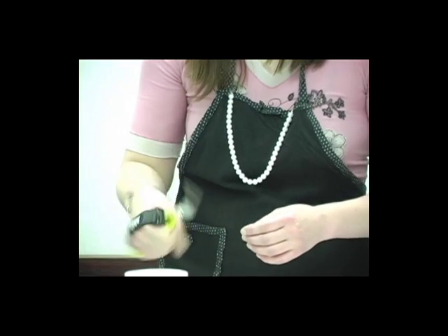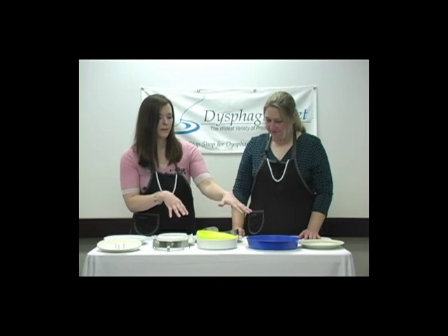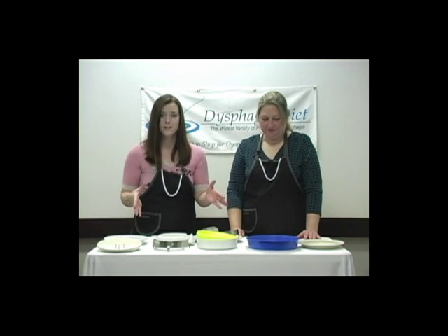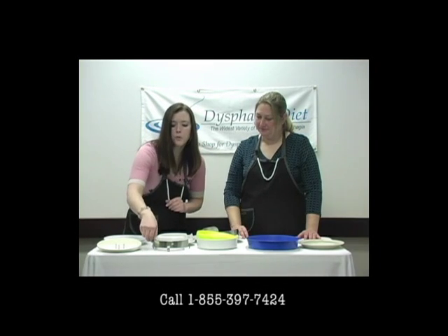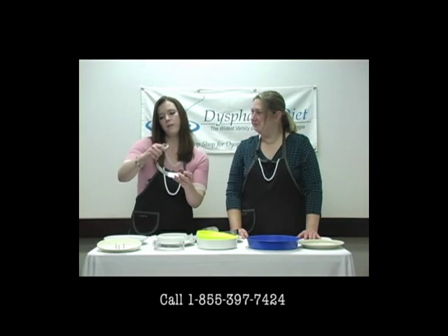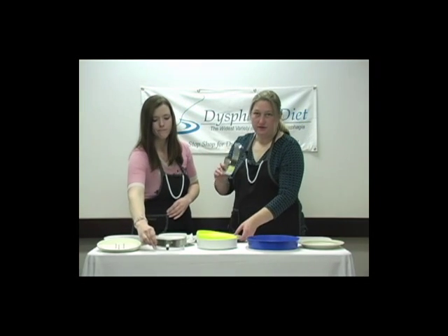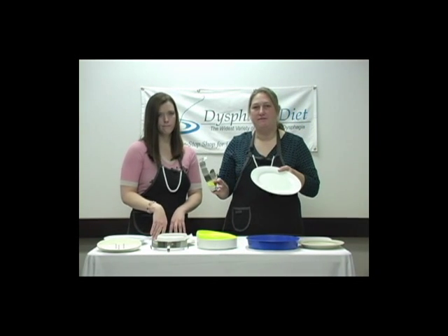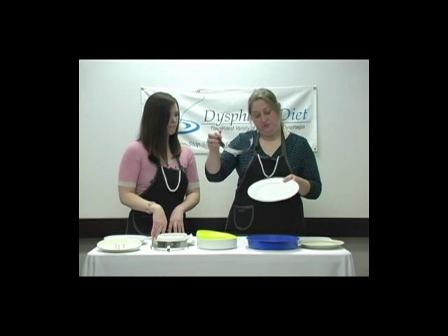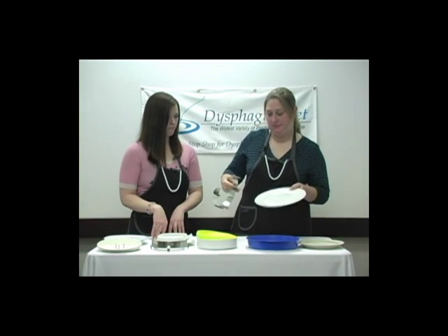Cool. The next group of items we want to talk to you about are plate guards and adaptive plates. These come in many different sizes and materials, so if you need help selecting one, just give us a call. A particular plate guard will be measured to fit plates of a specific diameter. For example, this plate guard is measured to fit plates of a 9 to 11 inch diameter. So if you want to measure the diameter, you just go from the top to the bottom of the plate.